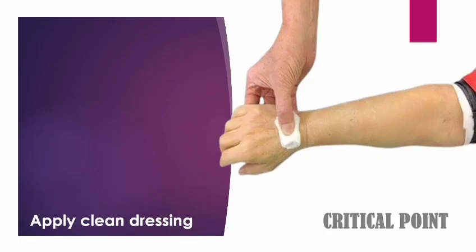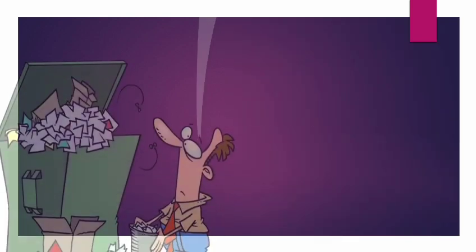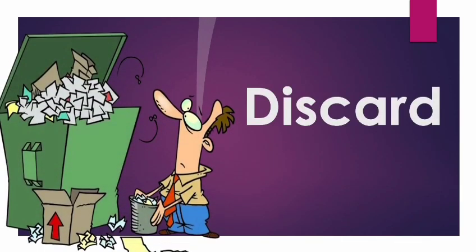After removing the IV line, apply pressure with gauze on the insertion site which was opened. This is to make sure that you prevent bleeding. Apply the pressure for about 2 minutes. This is also a critical point. Discard the tubing and the empty vacolitre, including the dirty gauze that you've been using on the patient. This is to prevent cross-infection.